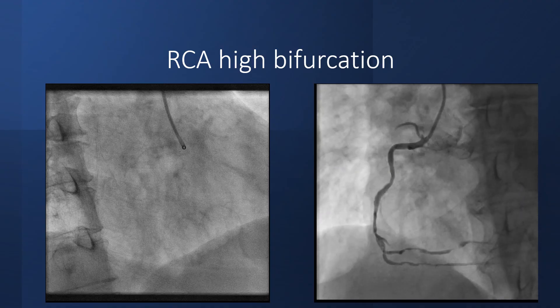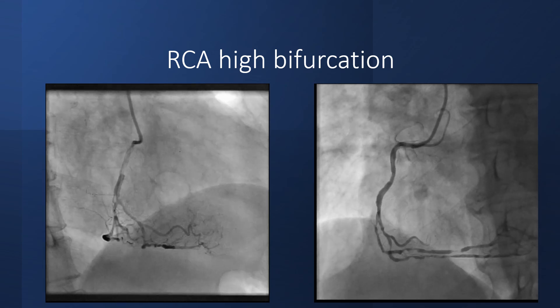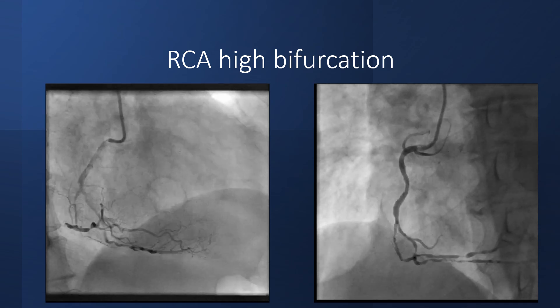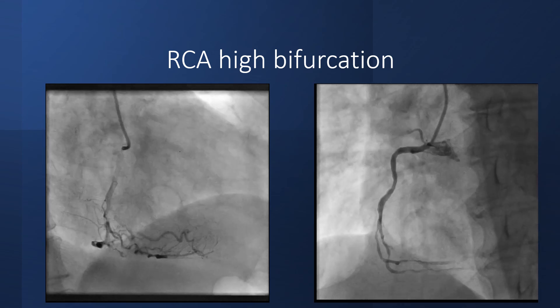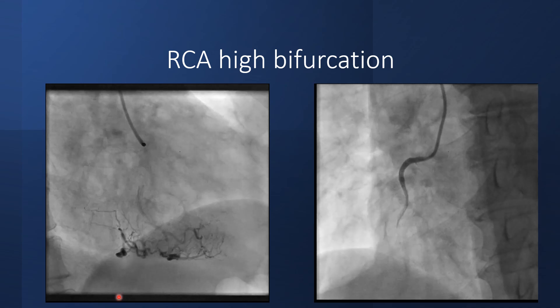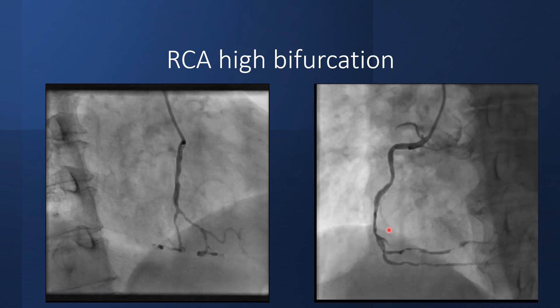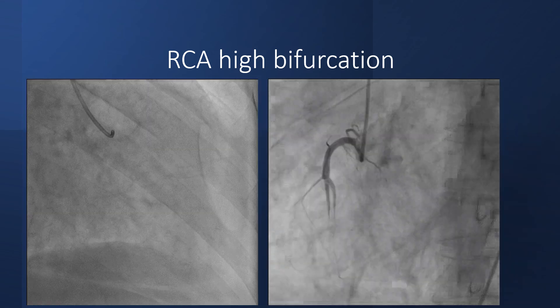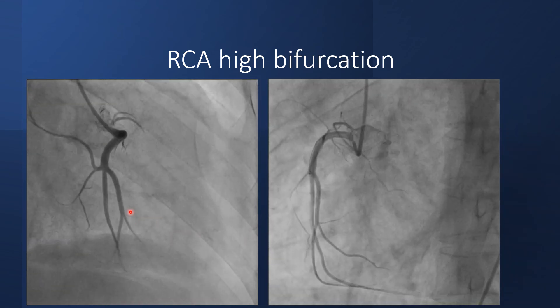The RCA usually bifurcates at the crux of the heart into the PDA and the PLV, but in some cases there is a high bifurcation, more proximal. In this case, the bifurcation is at the middle part of the RCA, while in this second case, the bifurcation is more proximal.